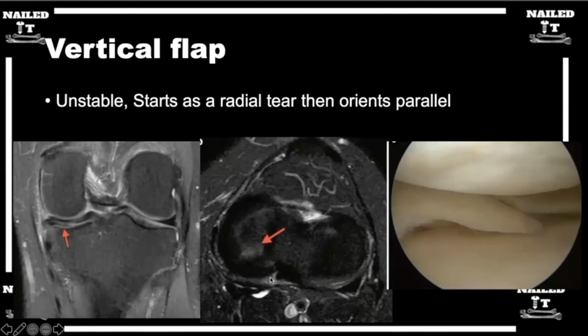You get into the knee, you flip it back over and you see, all right, well, depending on where that radial tear exits, if it exits all the way in the periphery in a young knee with otherwise good cartilage on top and bottom, like that picture shows, that might be something you get more aggressive on in the young patient. But if that tear stops right where you're seeing it, that's poorly vascularized tissue that was out of place, being beaten up, that looks very plastically deformed, very rounded off edges, that looks more chronic in that picture you have there. That's probably something I'm going to clip out rather than trying to be heroic, unless it's a really young patient who it's worth a try for a bigger radial split.